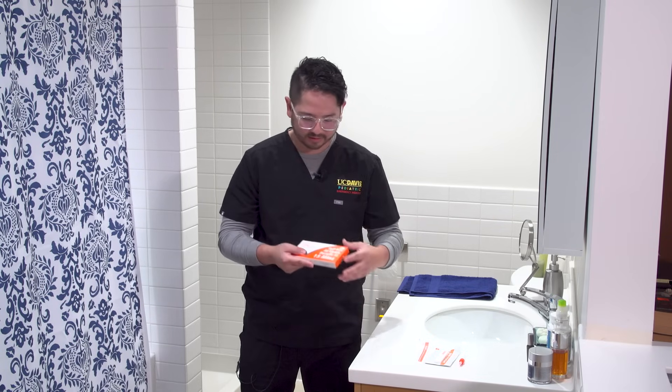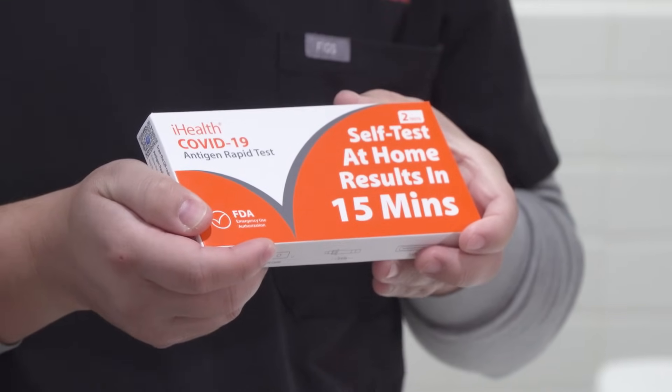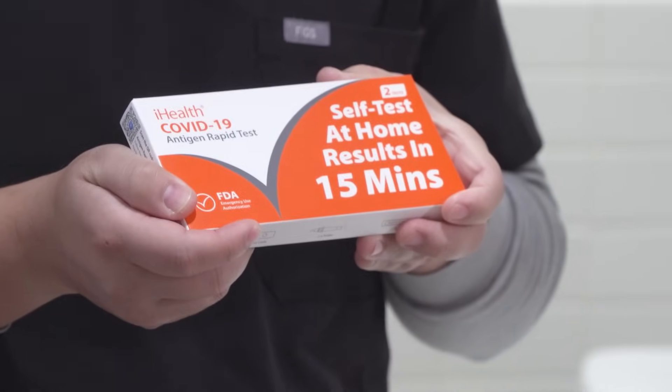Hi, my name is Claudio Alvarado and I work in an emergency department here at UC Davis Health. Today I'm going to show you how to do a home COVID-19 test. The kit we'll be using is called iHealth COVID-19 Antigen Rapid Test, which is a fairly common test to use at home.